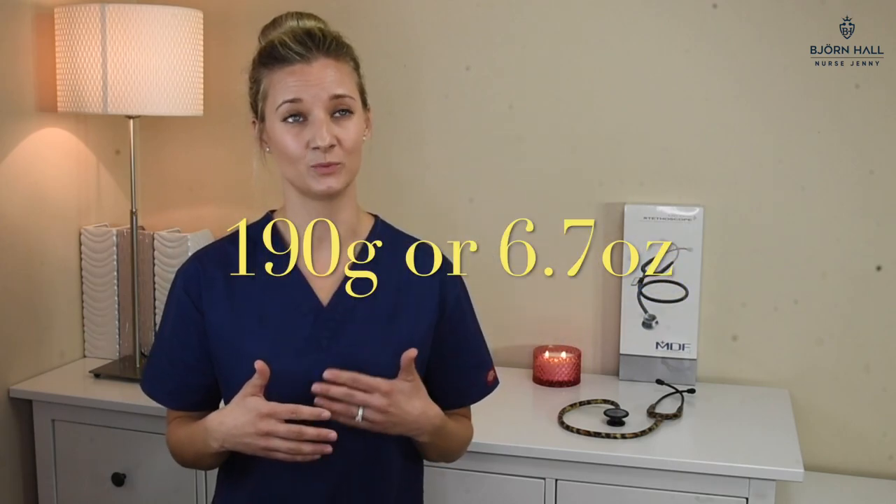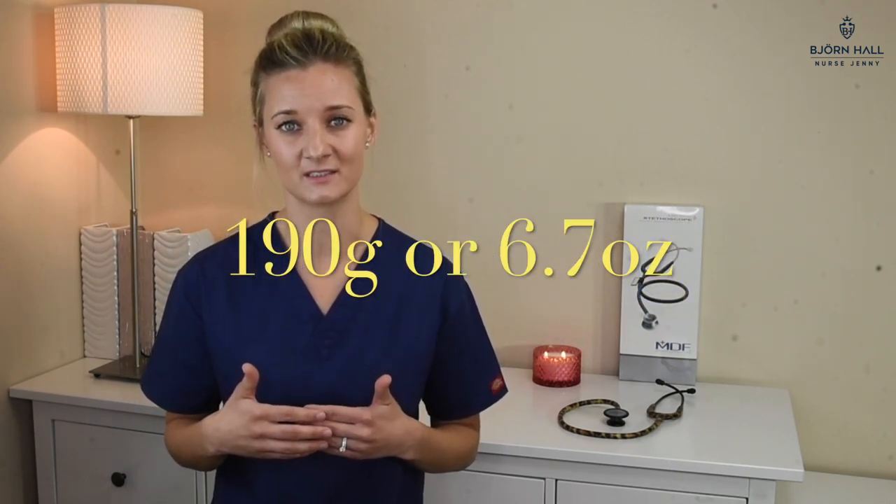The weight of this stethoscope is 190 grams, which is 6.7 ounces, and too heavy for my liking. I found that when I had it around my neck all day, I could really feel it. Also, the chest piece is a little bit too heavy for the binaural, so it would just slide down and I would have to correct it constantly. I've given it a two out of five.